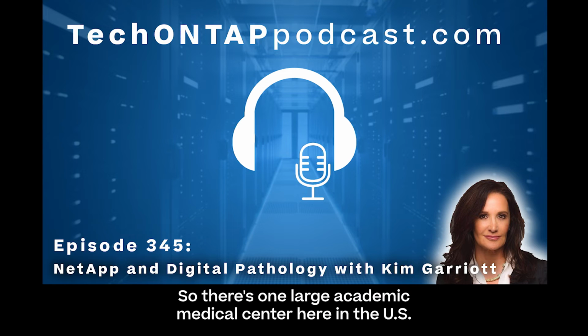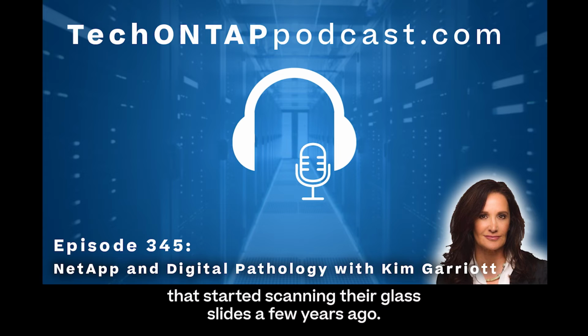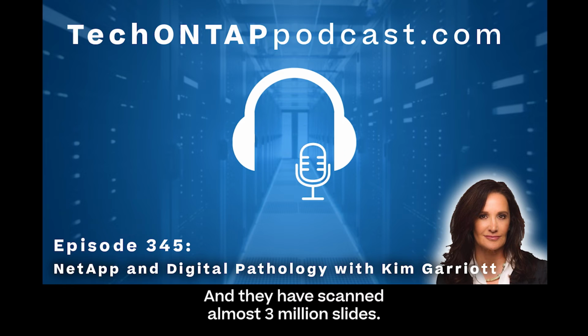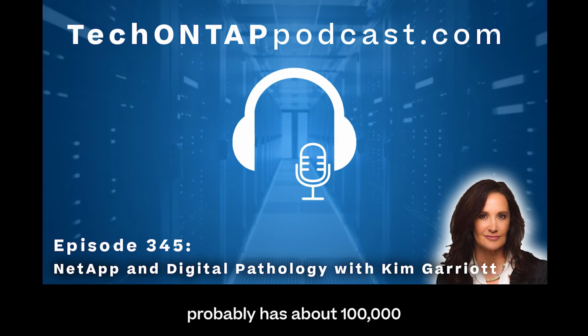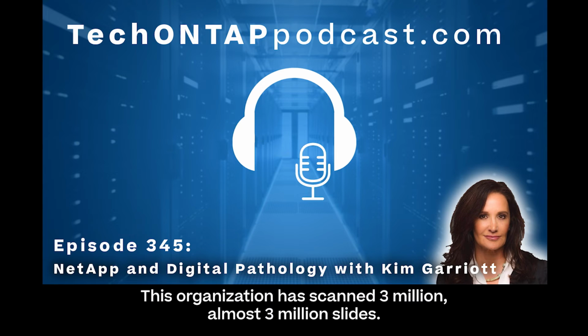I'll give you a couple of interesting statistics. There's one large academic medical center here in the US that started scanning their glass slides a few years ago, and they have scanned almost 3 million slides. And just to put that in perspective for you, a medium-sized hospital probably has about 100,000 pathology studies a year on their patients. So that would be 100,000 glass slides. This organization has scanned almost 3 million slides.